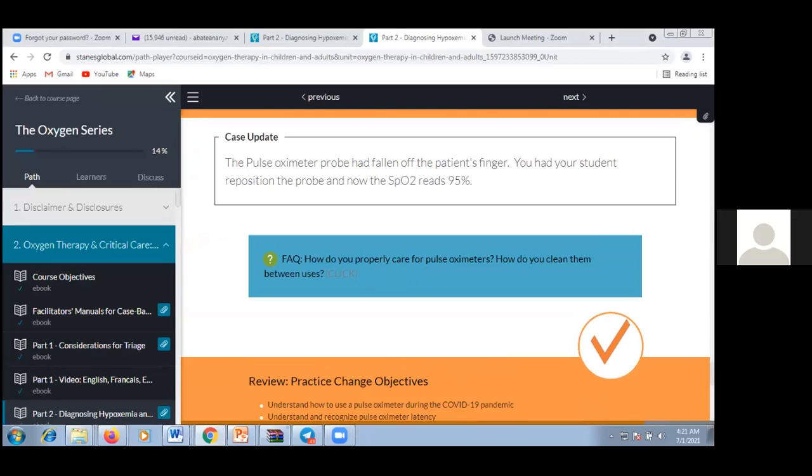During cleaning, we have to swab it with alcohol or water soaked with soap. These are the practices that we are doing, and that should be done. In cleaning, we have to avoid using acids, bases, immersion into water, and other cleaning agents. The other thing that damages pulse oximetry is heat. In the hospital where I practice, it's very cold.